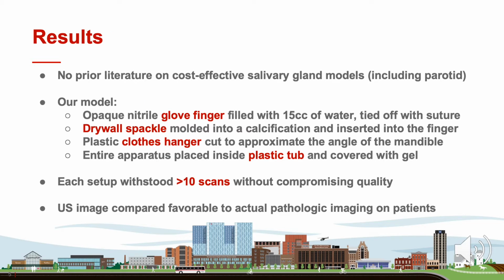Our results showed no prior literature on cost-effective salivary gland models, including specifically the parotid gland. But our literature search included all salivary gland models, and we were unable to find a non-commercial model that had proven to be representative of actual pathology on ultrasound.